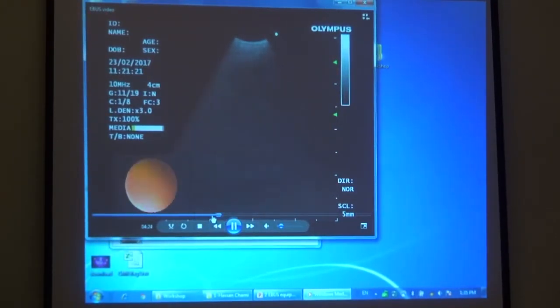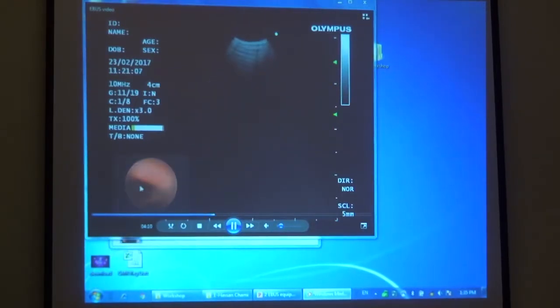Okay? So again, just to appreciate what we're doing. Here you're in the trachea. This is exactly where you're going to see the AP window. So you're going to go against the wall. This is the aorta. This is the mass. This is the pulmonary artery. You're not seeing really the Mickey Mouse because the mass is so big. So this is the pulmonary artery that's squished.